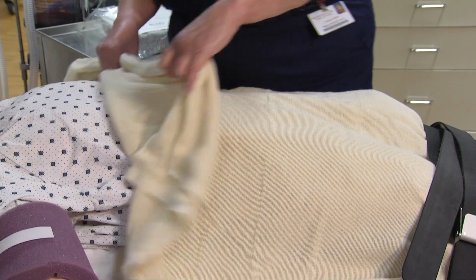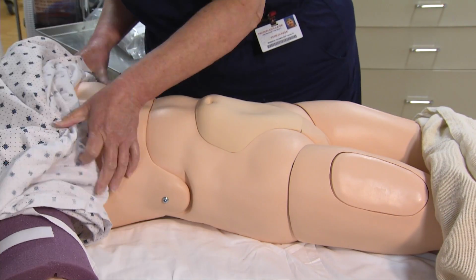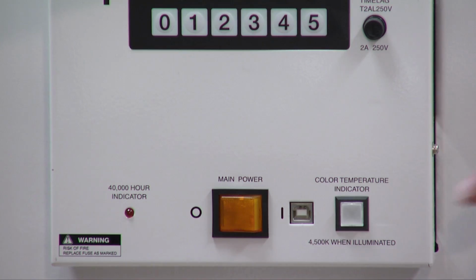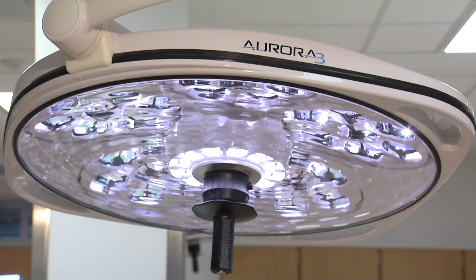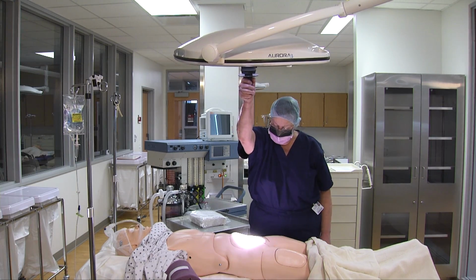If the patient is awake, be sure to identify yourself and explain the procedure you will be performing. Today, the patient is asleep, and we will move forward with exposing the surgical site, turning on and positioning the lights. If necessary, hair is removed prior to performing the skin prep.